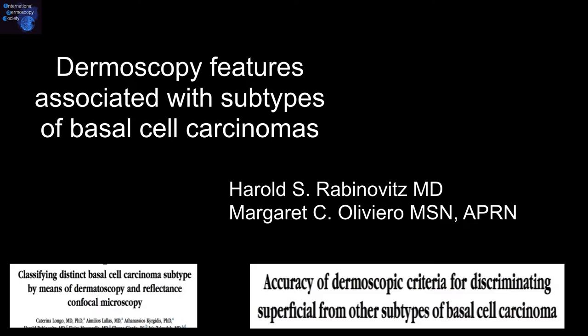Let's talk about the dermoscopy features associated with subtypes of basal cell carcinomas. There are some recent articles on classifying basal cell carcinomas according to the cell types.